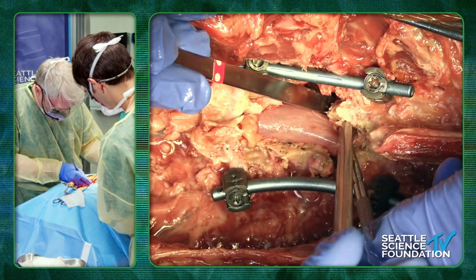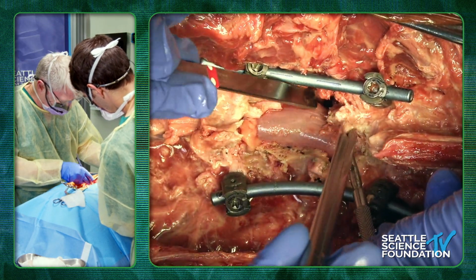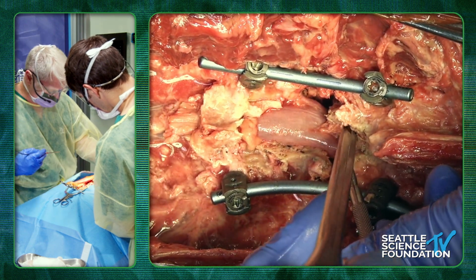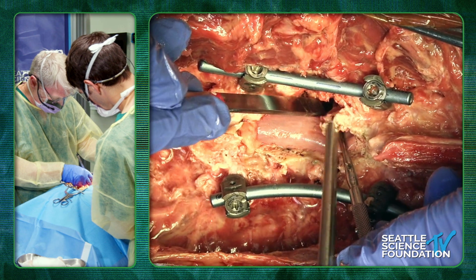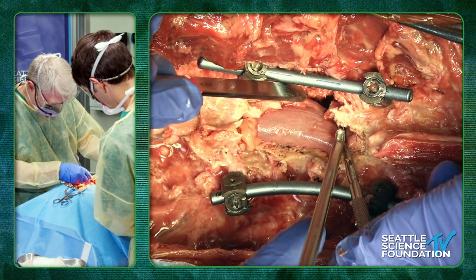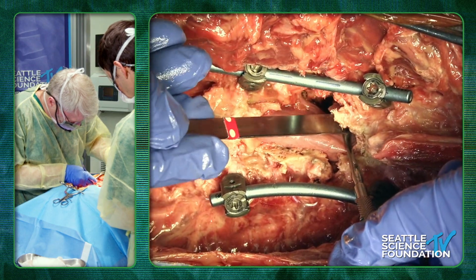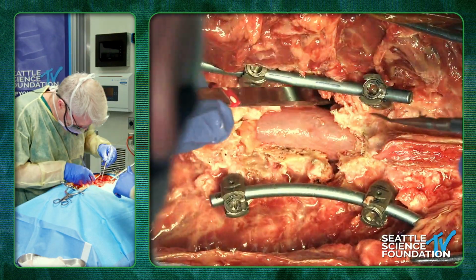And then one of the big mistakes people make is leaving some pedicle. So that may be one of the issues. And then the other issue is sometimes there's a posterior osteophyte off the disc space that wasn't addressed when you did your resection, that needs to be adjusted. We only see the back, but it's the ventral part that we're more concerned about. But in principle, you'd have between those two pedicles two nerve roots in one foramen, right?